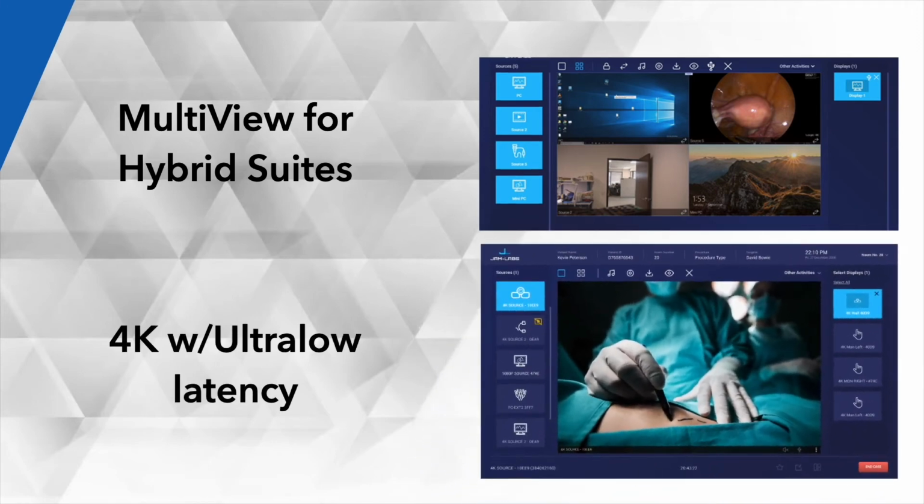Ultra low latency. I'll give you an example. A kid who plays video games, and you can see there was an implementation of a 3D video game, and it's great, but play it for 15 minutes, and then you start introducing fatigue in yourself, right? That's because the hand-to-eye coordination has lag. So a surgeon who is operating on a patient, if the hand-to-eye coordination is lagging, anything more than 2 frames, he will, hands down, find out that he is fatigued after a couple of hours.